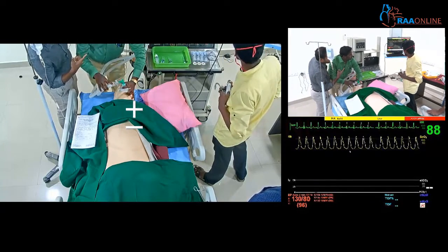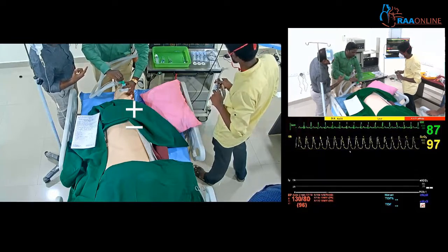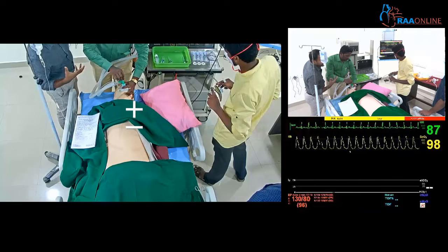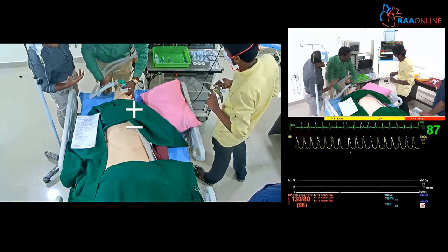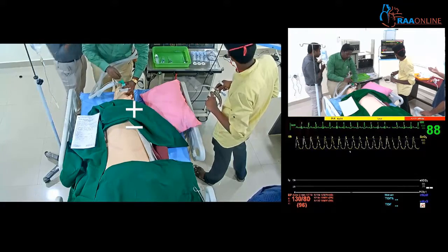What about ETCO2? Is ETCO2 available? So that we will check the adequacy of ventilation with ETCO2. May I get ETCO2? Oh, it's not coming, doctor. No, sir. Then we are desaturating. Do something faster.